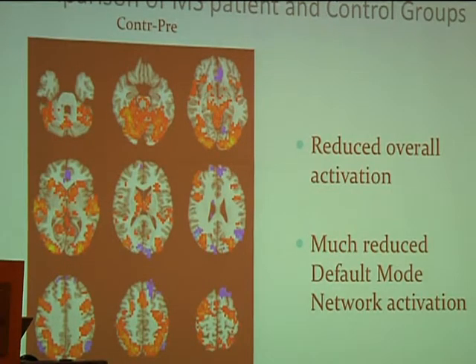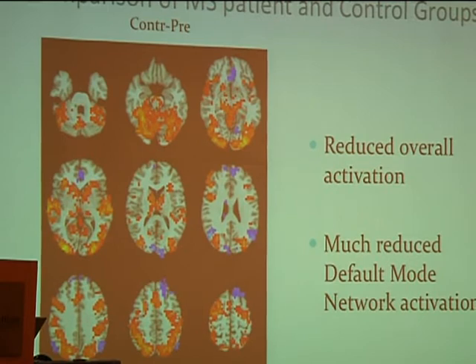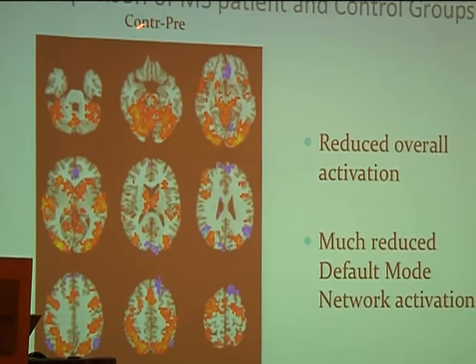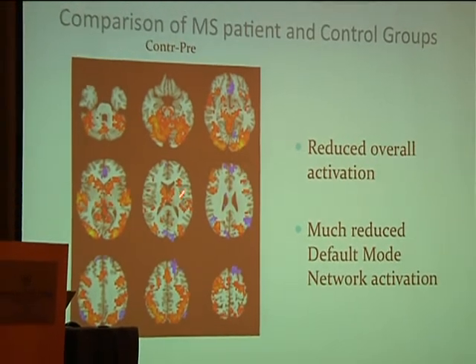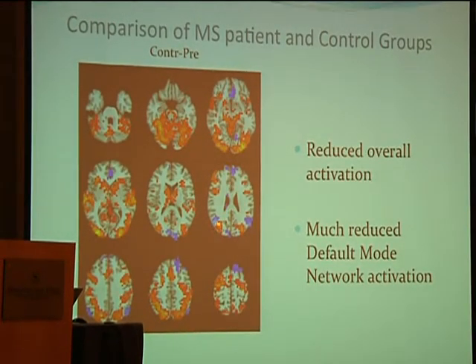So this is just a zoom in. That's a difference again of the two groups. So this default network, as you can see, is very well defined. It's very characteristic, and it shows up in many states.